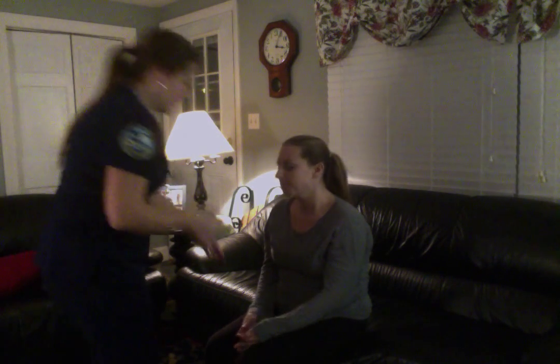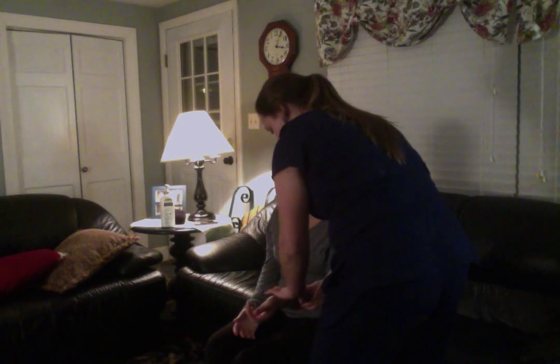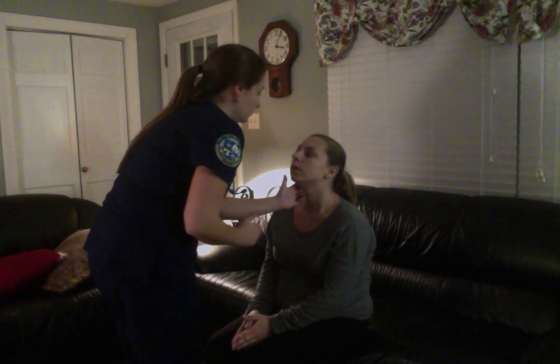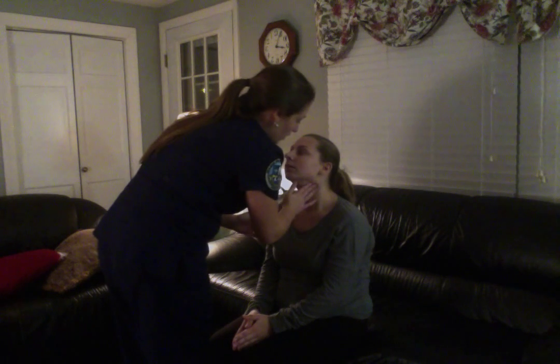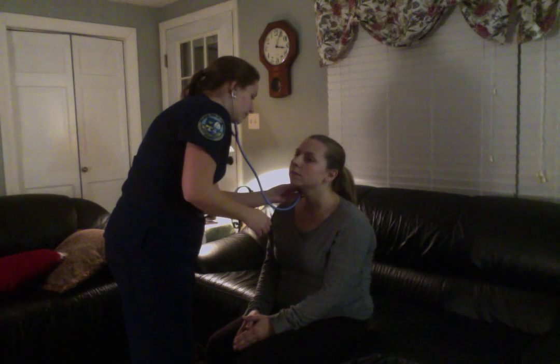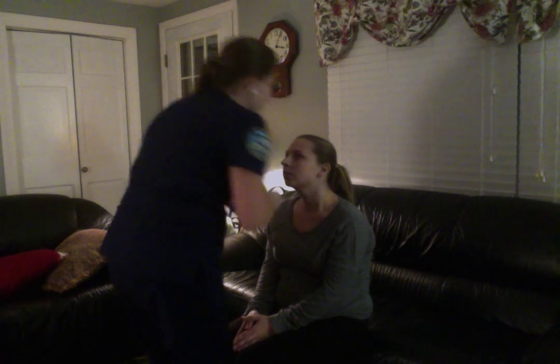I'm going to check your radial pulses. Radial pulse is strong and present. I'm going to check your carotid pulse. Your carotid pulse is strong, no weakness. I'm going to listen with the bell. Pulse is strong and present, no abnormalities.